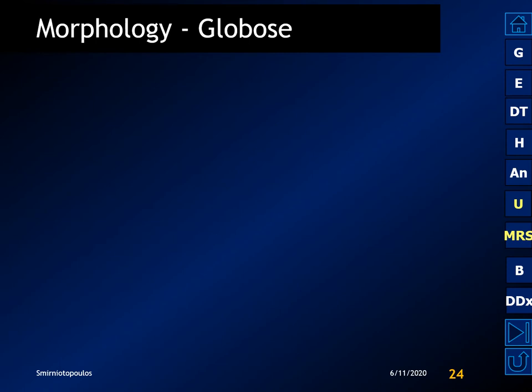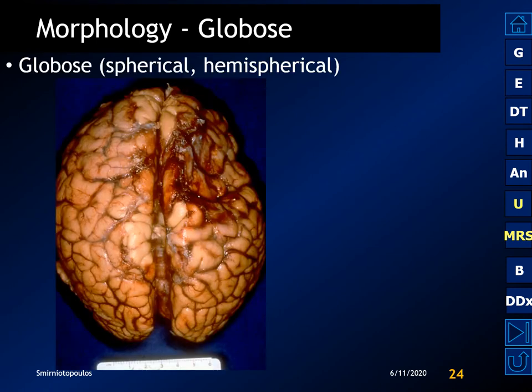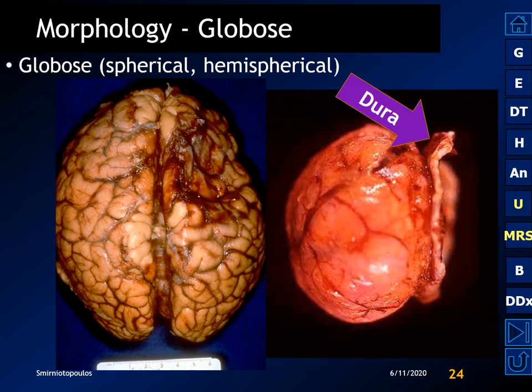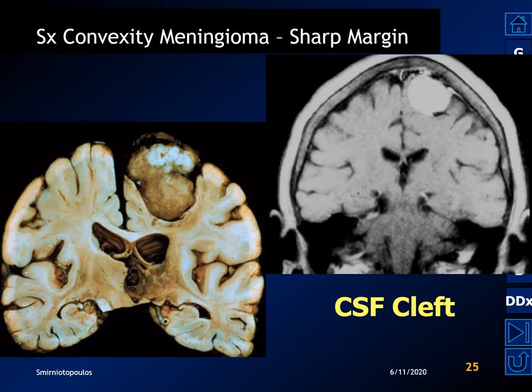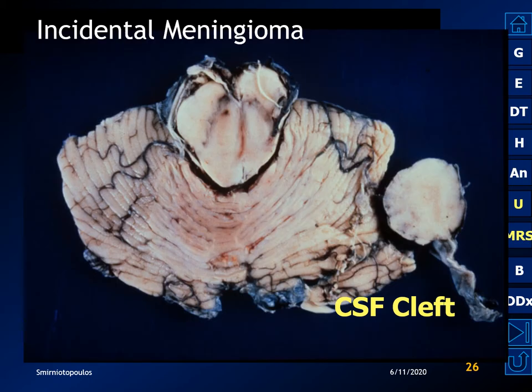The globose meningioma is shaped like a hemisphere. Growing slowly, it produces a smooth indentation on the cerebral surface and clinically presents with findings for involvement of that area of the cortex. Meningiomas very commonly have a CSF cleft — a space separating the tumor from the brain that facilitates neurosurgical resection. Here is an incidental meningioma of the tentorium producing a smooth excavation of the cerebellar surface with a nice CSF cleft.